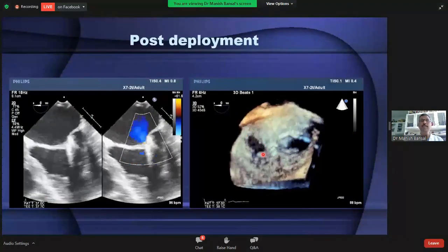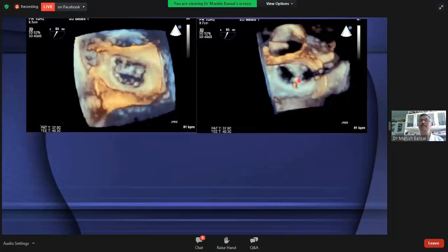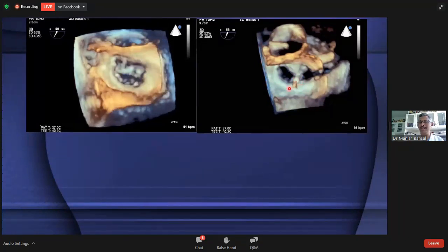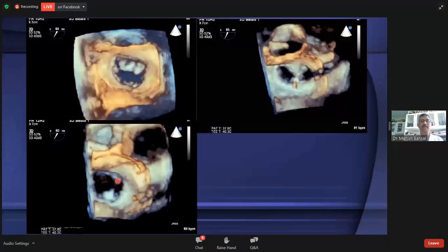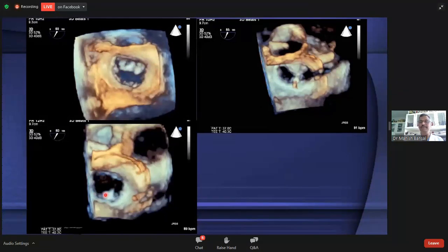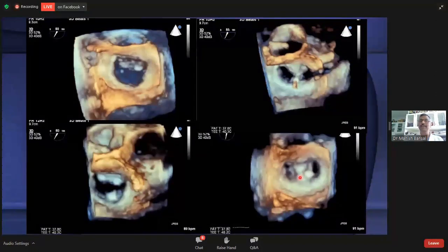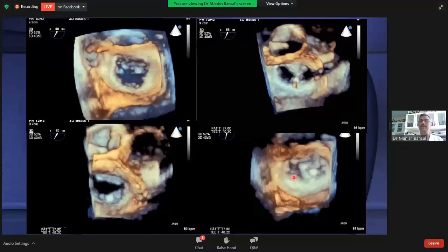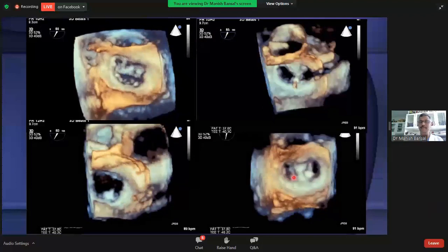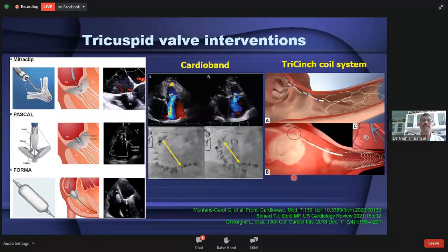In another example of secondary MR, when the clip was positioned everything appeared very good — double orifice valve, no MR — but when the clip was deployed, the anterior mitral leaflet came off and the clip was found hanging only on the posterior leaflet. Another clip had to be deployed just lateral to the first. Under 3D guidance, the original clip and the second clip holding both the anterior and posterior leaflets together were visualized, and after deployment of this second clip, MR completely disappeared with no significant gradient.